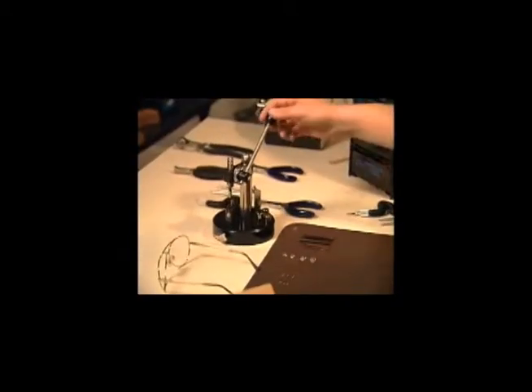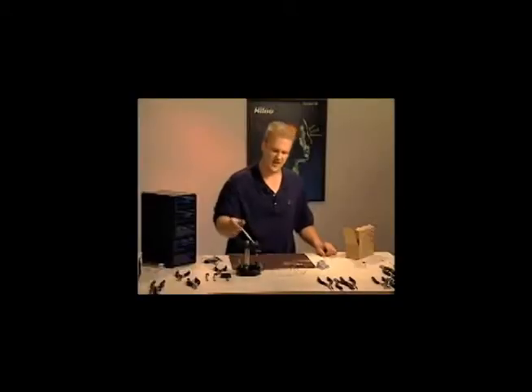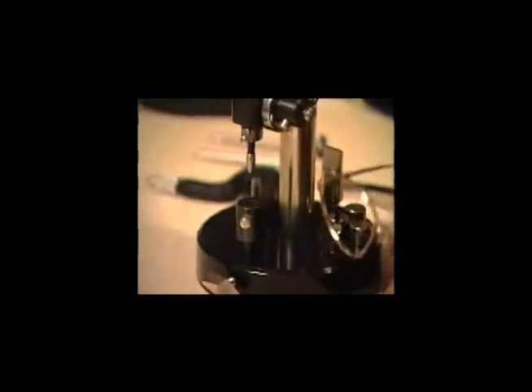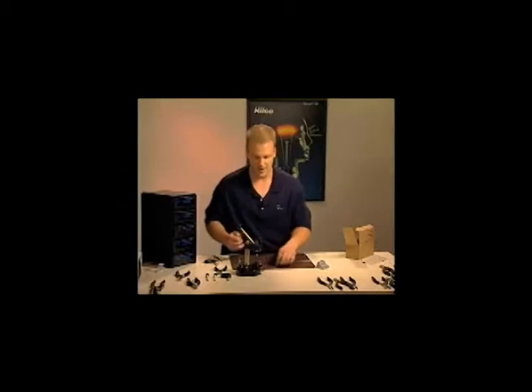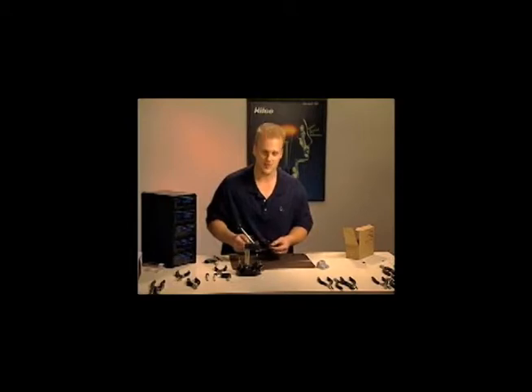If any of the previous methods of screw removal didn't work for you, by using either the screw extractors or the ribbon files, and you want to try to punch out a broken screw, many people try using a staking tool. It's kind of an old-fashioned method, and I find that it can be a little cumbersome trying to fit the different frame styles in this tool to try to get it to line up with this pin and punch it out properly. The tool was really designed to aid in repairing rivet hinges, and sometimes if you're lucky enough you can get it to punch out a broken screw.